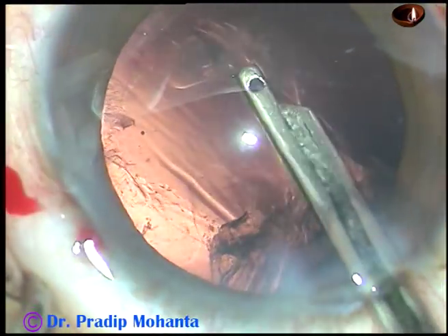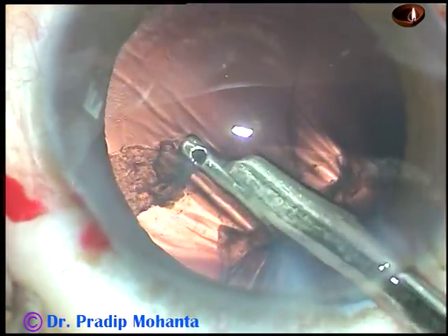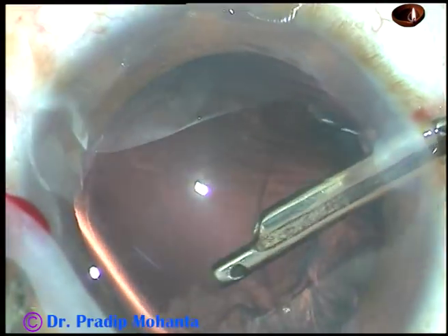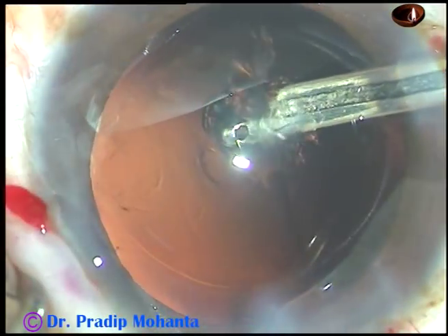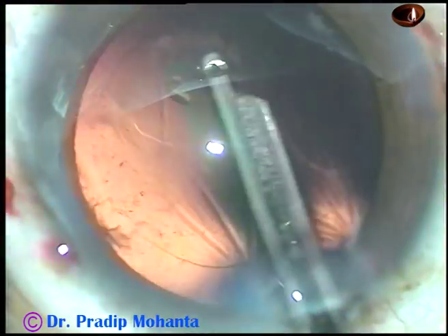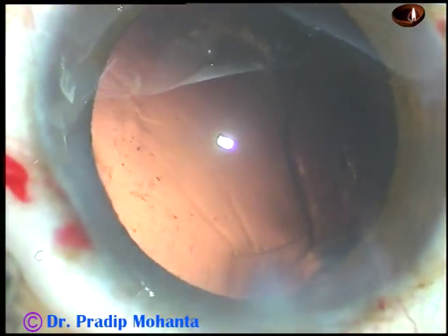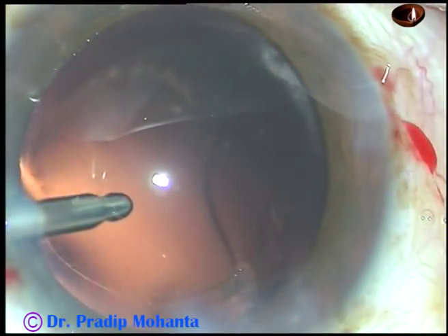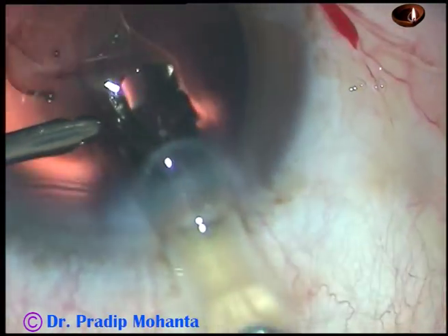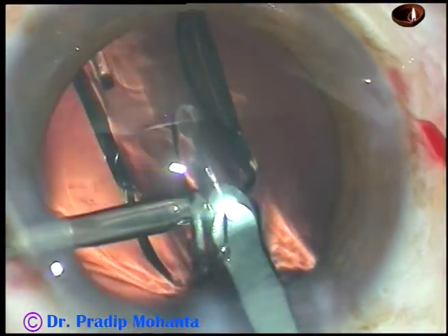Most of the cortex is removed, and only little bit of cortex is there superiorly. It is also removed. Little bit of polishing of the capsule is done, and now a hydrophobic acrylic single piece monofocal intraocular lens is being implanted, keeping the anterior chamber formed by irrigation.